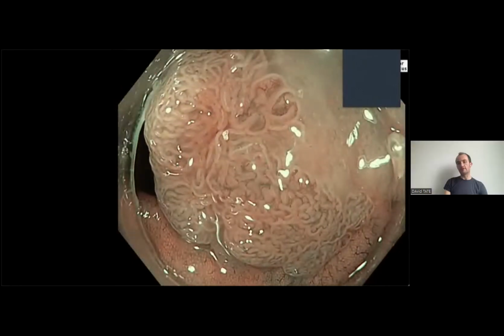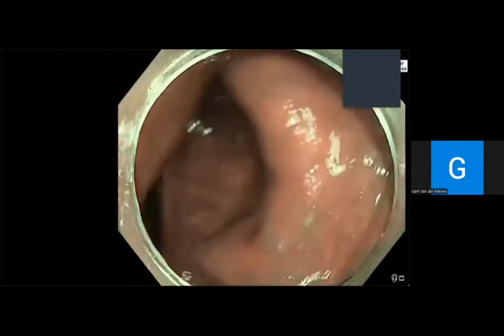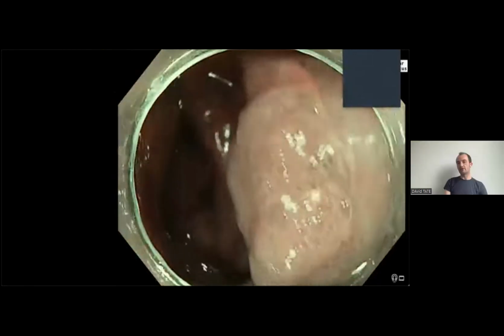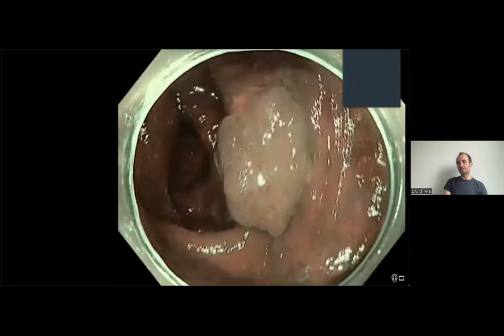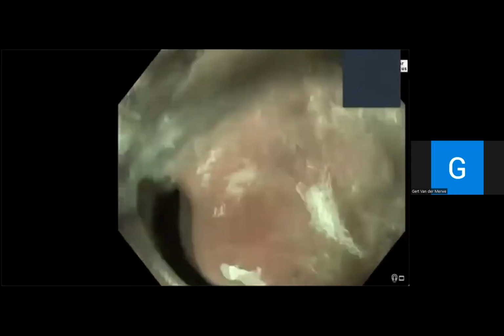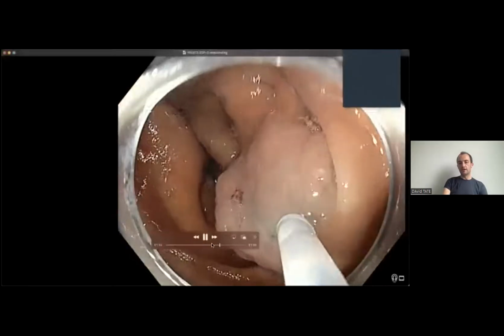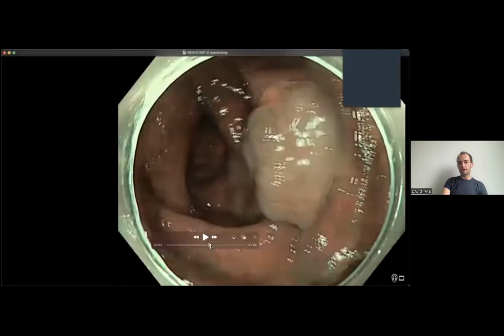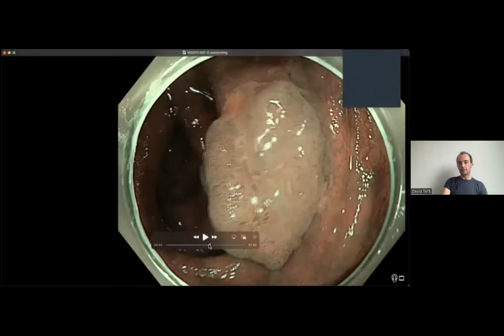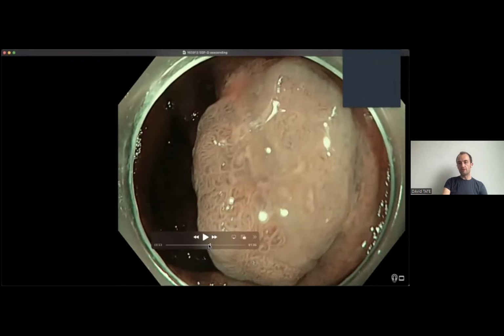Perfect. Okay, so please. All right, so there's clearly a demarcated area. There is indeed. Thank you for saying that. We just need to get a better image on it. We're starting to cut it out. So we'll just freeze it a bit on that demarcated area, maybe. So that's not a bad view of the demarcated area.